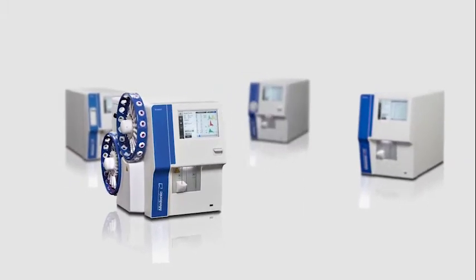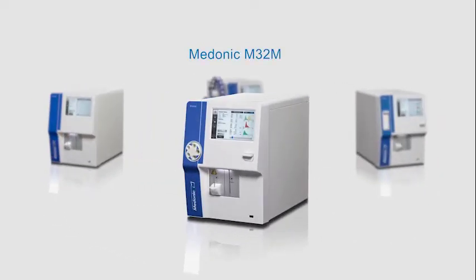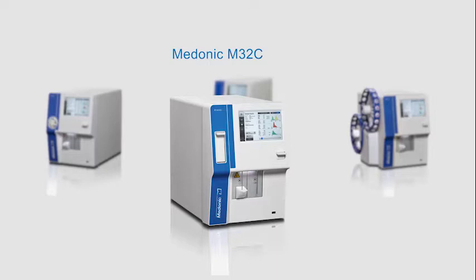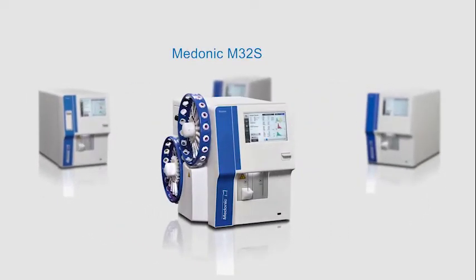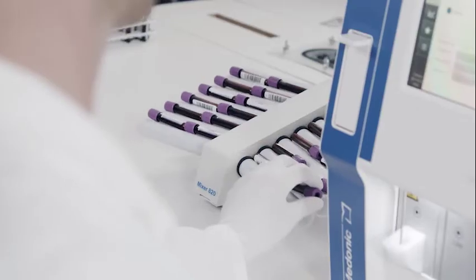Four different models are available: M32B Basic Model, M32M for the mainstream laboratory, M32C featuring closed-tube sample handling, and M32S with a walk-away tube sampler. Whichever you choose, Madonic M32 will occupy pride of place in your hematology lab.